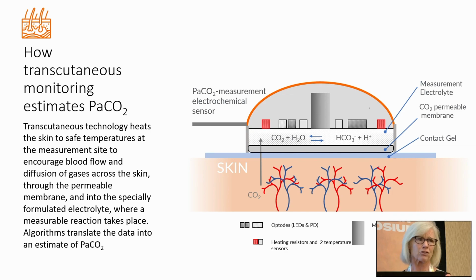When I first started using this technology, I didn't know that, and so I was working in a NICU and I would swaddle the kid real tight, you know, make sure that sensor was really up against the skin, and I was wondering why my CO2 was off by 15 points.